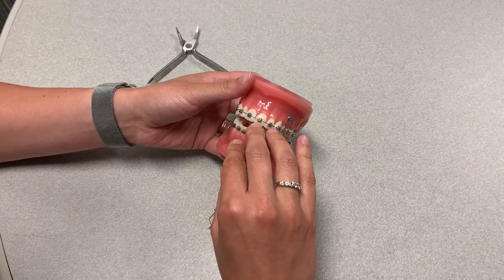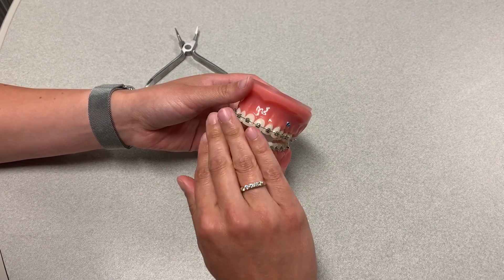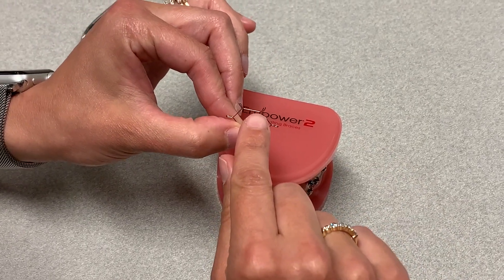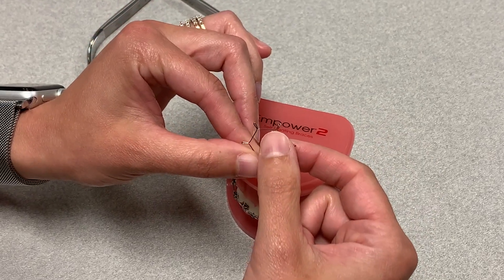In that case we want to make sure the straight edge of the appliance is on the incisal edge of the tooth so that it's de-torquing. On the middle bend, the art spring has a little bit of a hook on it, and you want that to be in between your two centrals.